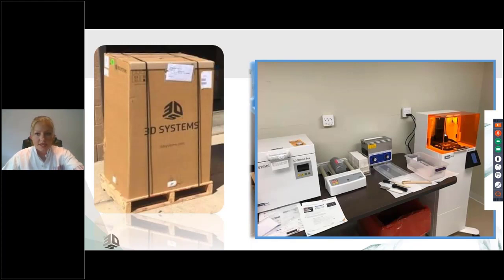Some offices have a really nice setup. I just want to show you the other setup here that I have. It's a hidden picture, but it's worth a view. Okay, so some people will do a nice little setup like this. So you can see that the picture on the right, it's on a pedestal. You can wheel it around. You can put it in front of your patients. My dentist has a mill in the waiting room, you know, and it's cool. He lets you start it yourself.